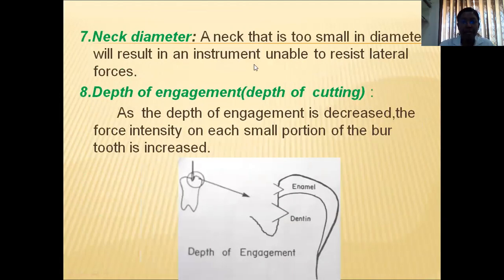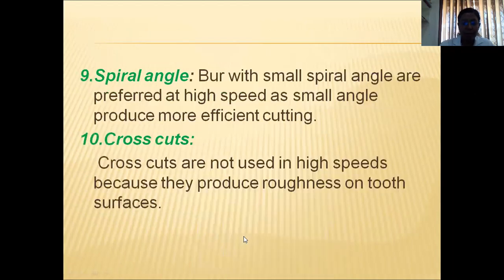Neck diameter. A neck that is too small in diameter will result in the instrument being unable to resist the lateral forces. Depth of engagement. As the depth of engagement is decreased, the force intensity on each small portion of the burr is increased.